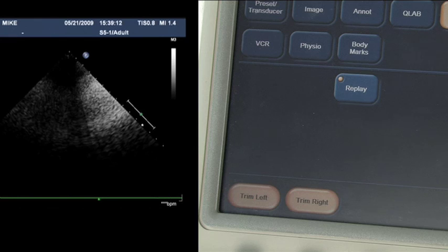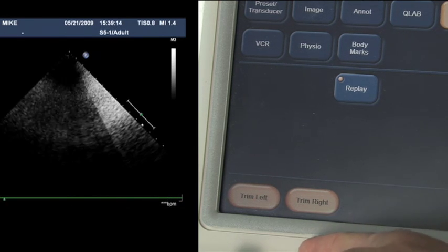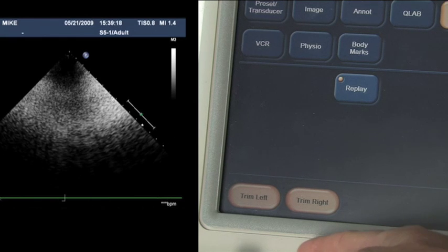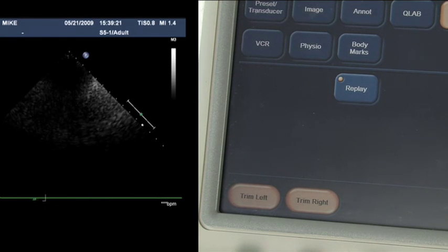If we trim the right, you can now see the right marker scroll in, and now the amount of time we're showing is less. So if there was an ECG, and it was multiple beats, we could easily jump to earlier or later beats.